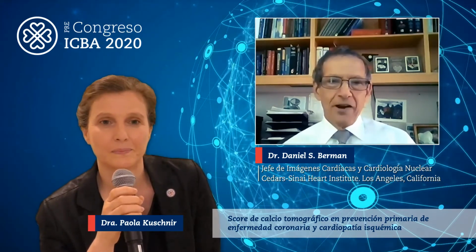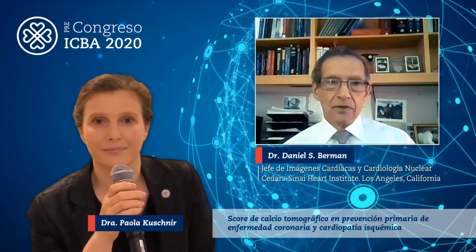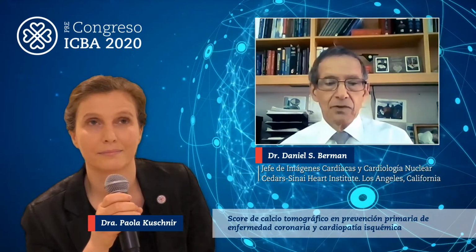So the coronary artery calcium scanning is a very simple test for a CT scanner. The CT scanner has to be fast enough and a modern generation in order to get a good stop action scan of the moving coronary arteries. It's recommended that at least a 16 slice scanner, but preferably a 64 slice scanner be utilized.